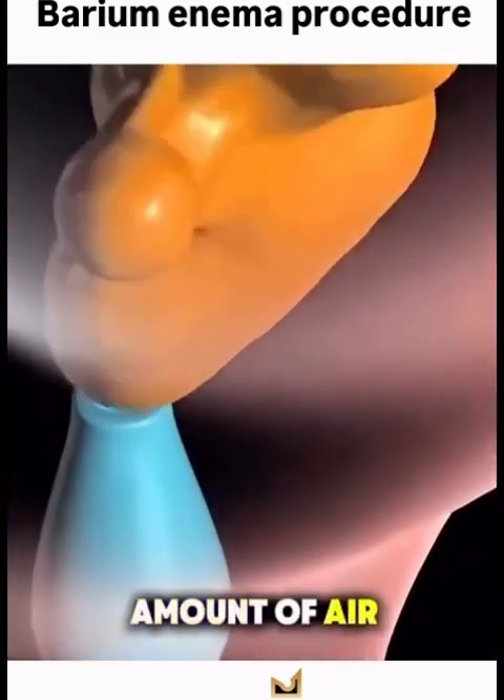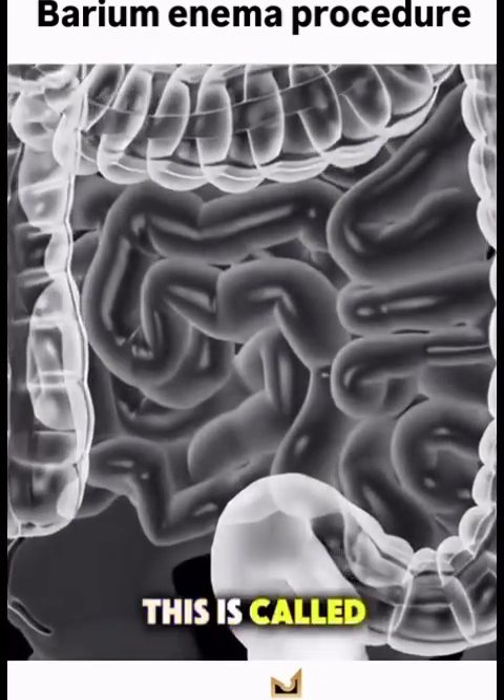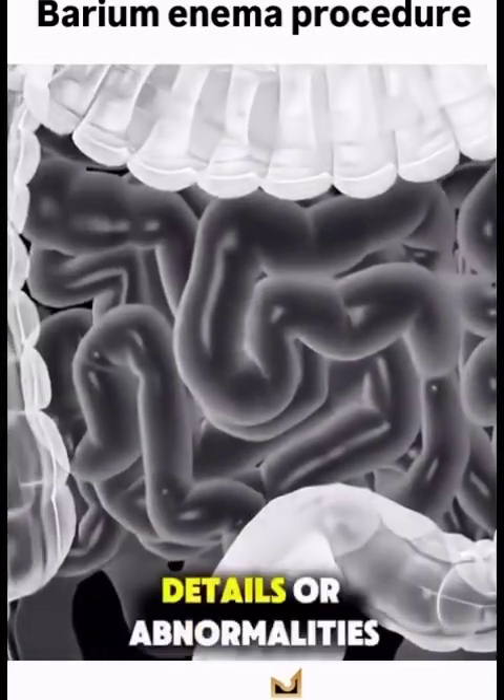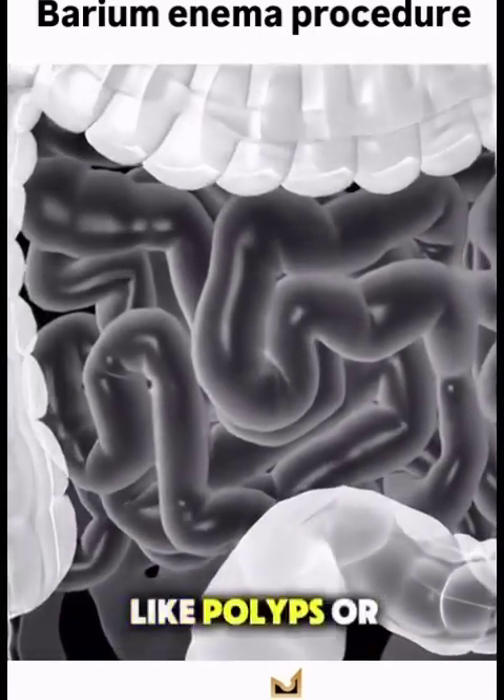Sometimes a small amount of air is also added. This is called a double contrast barium enema, and it helps highlight even tiny details or abnormalities like polyps or tumors.